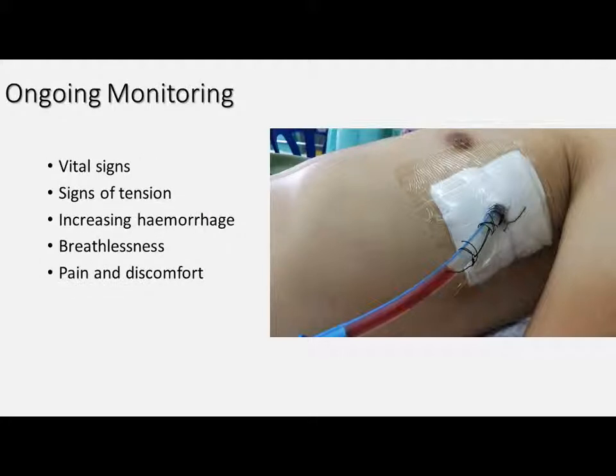And obviously our patient has a chest tube for a reason. Now, they've had some either chest surgery, a chest injury, or some other pathology within the chest there that's caused them to require this chest tube. So we need to continue to monitor our patient for clinical signs of tension physiology and intervene if we need to.